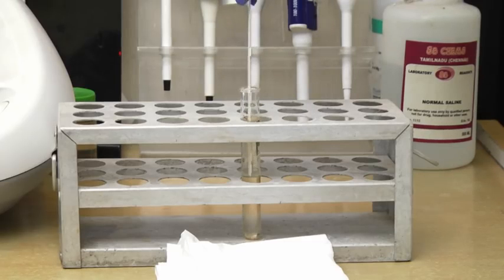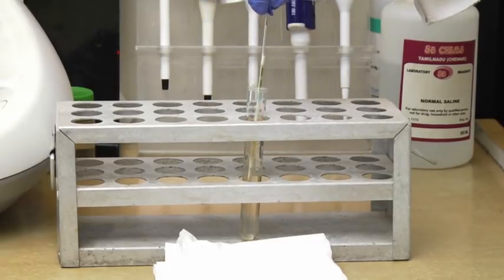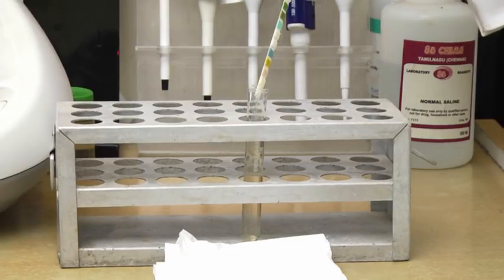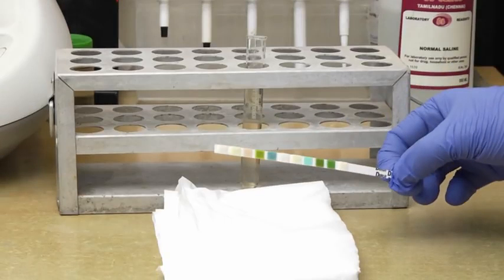Without touching any test area of the strip, dip the strip in the sample and remove immediately. Prolonged contact may result in dissolution of the reagents. Remove excess urine by running the entire length of the strip along the edge of the container. Hold the strip horizontally to prevent possible mixing of reagents from adjacent areas.